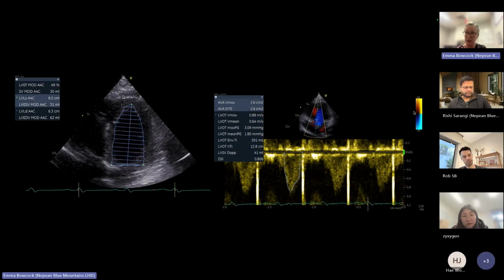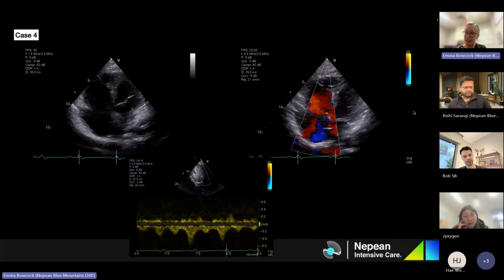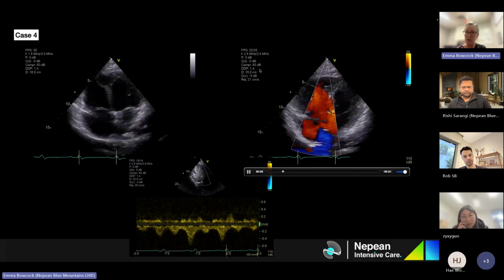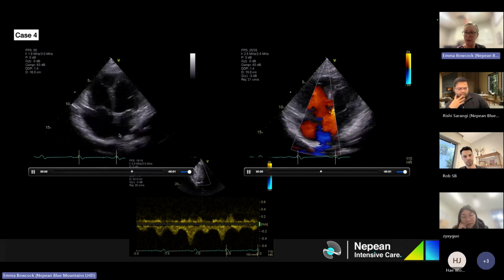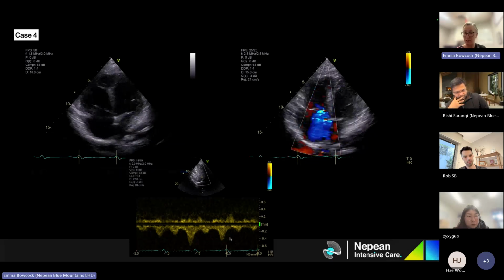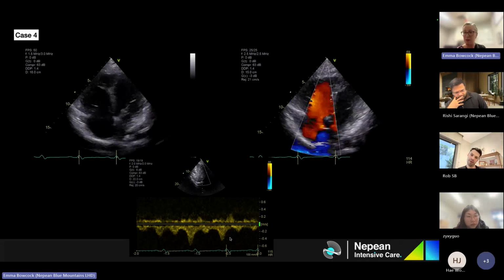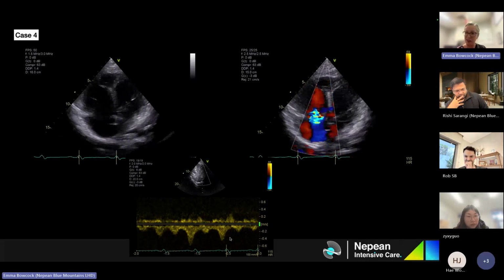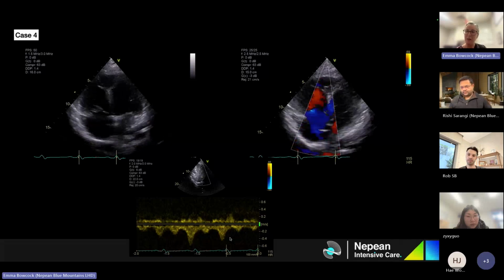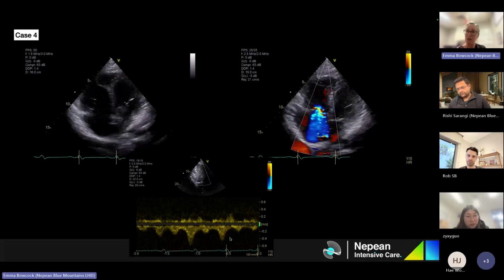There's other things that you could try and look at for that, I suppose. I guess in pregnancy, it's a little bit tricky. So you can look at the position of the intraatrial septum. Maybe it is slightly bowing across to the left. You could look at obviously the filling fraction in your hepatic veins. The IVC size and collapsibility can be helpful, but if it's not collapsing, it's not terribly helpful. You can look at, this is in non-pregnant patients, for right atrial pressure estimation.